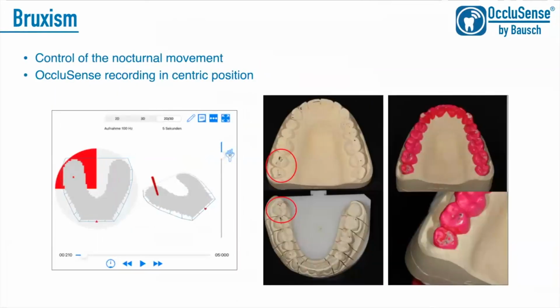And nocturnal movements showed us that in centric position, we still have a premature contact on tooth 48. So a very, very slight amendment of her occlusion, which included the fabrication of her static occlusion in the first place, taking out the 48 premature contact in her centric position, led to a severe bettering of her symptoms that she presented herself with at the beginning.